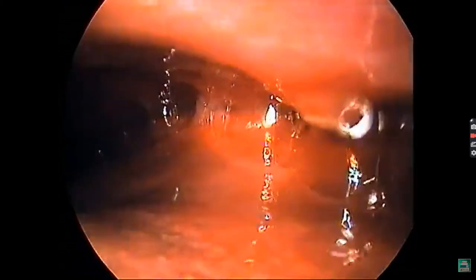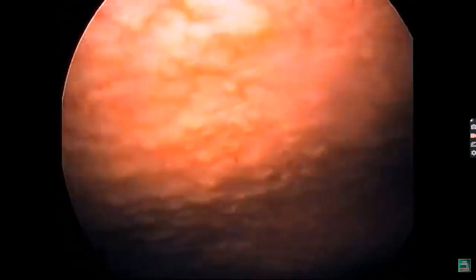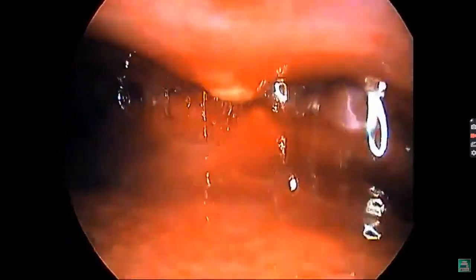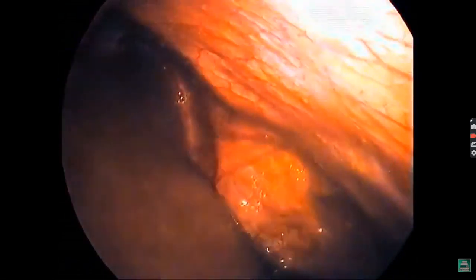So starting from the cecal area, going towards the hepatic area, then traveling towards the spleen or the left hypochondrium, we have seen almost every feature of abdominal tuberculosis that is mentioned in theory books.